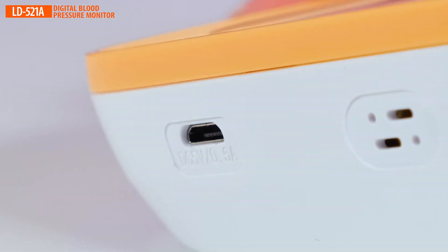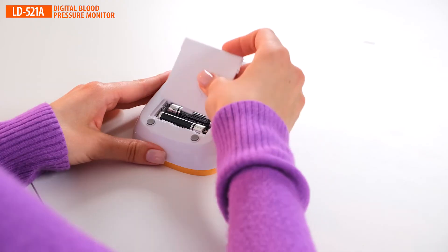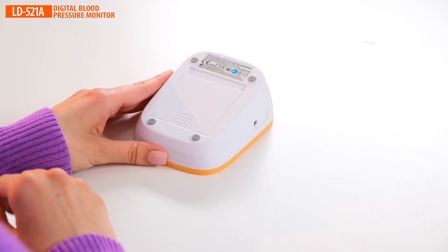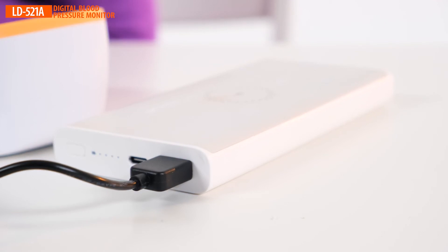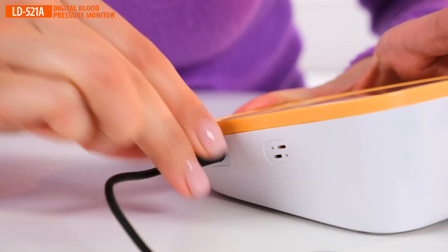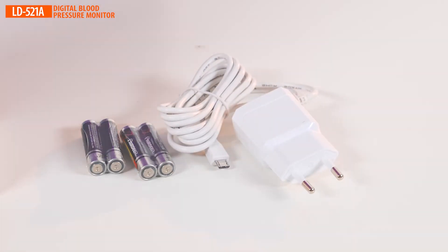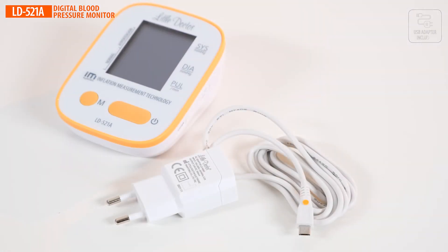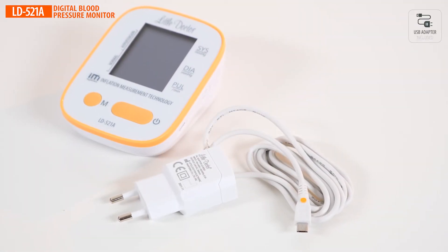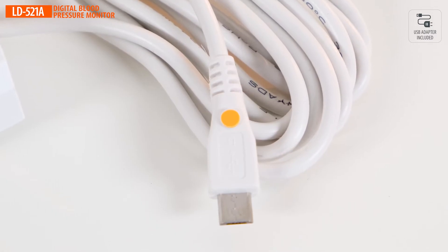The blood pressure monitor is battery-powered via a micro-USB connector. Any power adapter with a common micro-USB connector can also be used to power the device — there is no need to carry a special power adapter. The power adapter supplied is medical grade certified and will not interfere with other medical equipment such as pacemakers, making it extremely safe to use.